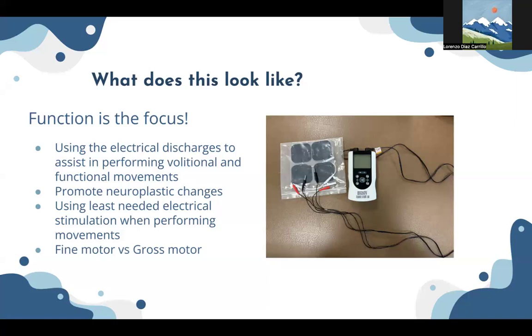Super tiny, they're all next to each other, so it's going to take a lot of trialing and cutting and just seeing what works and probably testing it on your clinical instructor or fellow colleagues. But essentially, stimulating those small muscles of the hand produces fine motor movements such as grasping, releasing, pressing buttons, finger extension, etc. It's tricky, I will say, but it is possible.